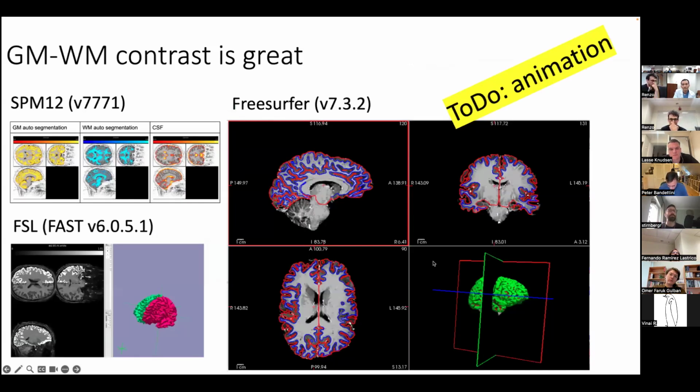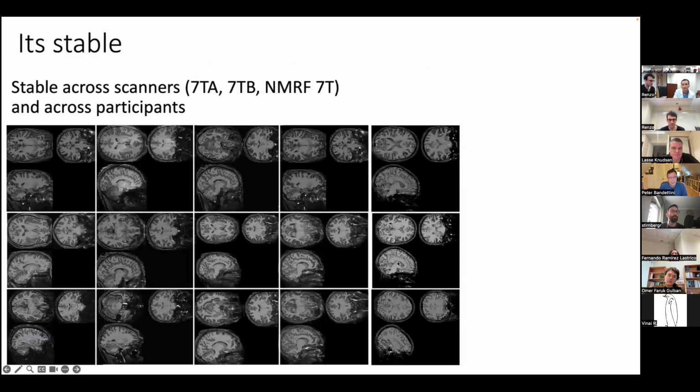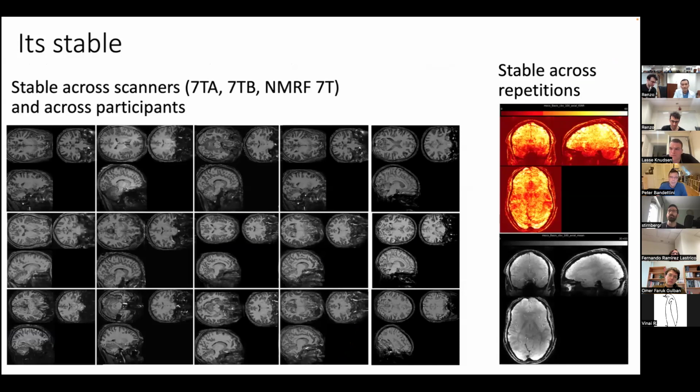With this protocol, the data give robust results of automatic tissue type segmentation across the major tools, foremost important for layer fMRI. It works out of the box in FreeSurfer with the quality level that we are used to getting from MP2RAGE. We are also quite happy how stable it is across the participants, as seen across 12 people here, with run-to-run stability tSNR of 50.